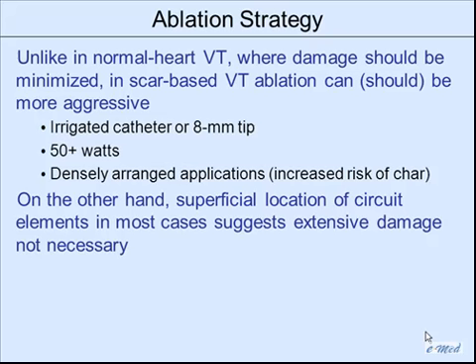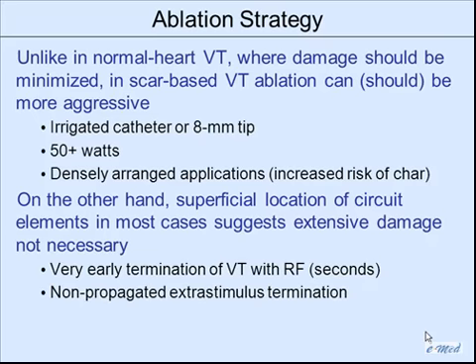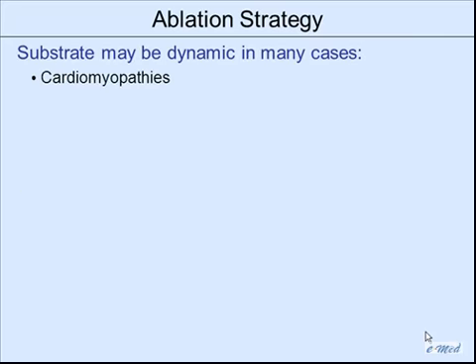These are okay to use in scar tissue. It's fine. You're not going to do unwarranted damage as long as you stay in scar tissue. You don't need that much energy typically, but as we see very early termination of VT with RF, you just don't need that much damage in most cases. And these are corroborative evidence of that.